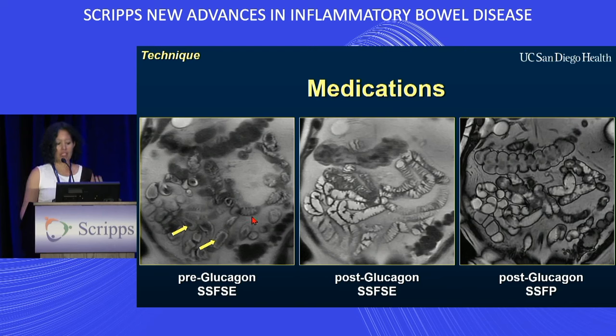This patient actually ended up getting the same imaging sequence both prior and following the glucagon administration. And you can see all these areas of fluffy dark signal within the bowel lumen due to dephasing from peristalsis ongoing at the time of imaging. You can see how distracting that can be compared to the exact same patient, just a few moments later following the administration of glucagon. The bowel lumen is nice and clean. We're not distracted by all this stuff that's showing up in the lumen of the bowel. We can better appreciate the full pattern and be more sensitive to the detection of abnormalities.